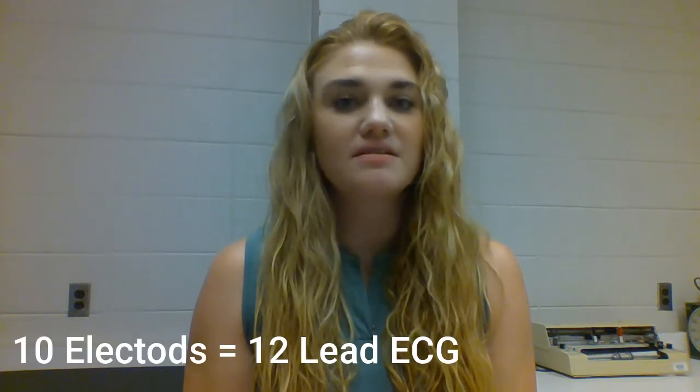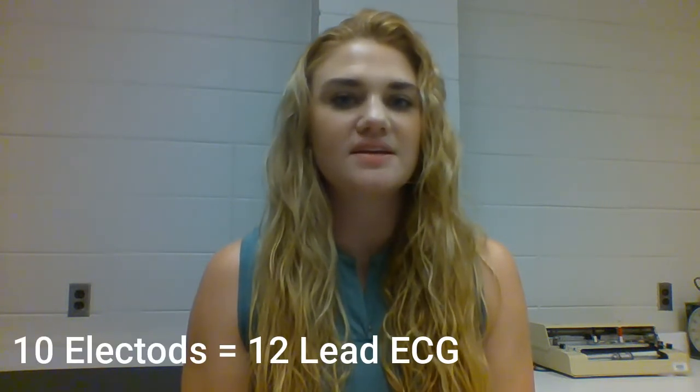These electrodes will generate tracings which we call the leads of a 12-lead ECG. Now, at this point, you might be wondering what an electrode is. An electrode is a small egg-like or round-shaped sticker with a gel center. Each electrode is placed at a specific location on the skin and has a metal snap where the ECG machine wires are connected. This allows the electrical recording of heart activity to be transferred from the ECG device to a tracing on graph paper for further analysis. We will typically use 10 electrodes to give us a 12-lead ECG.